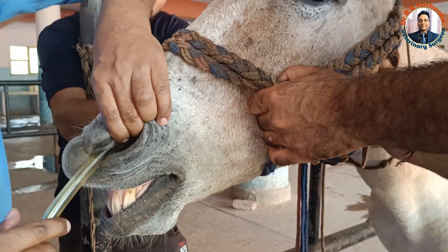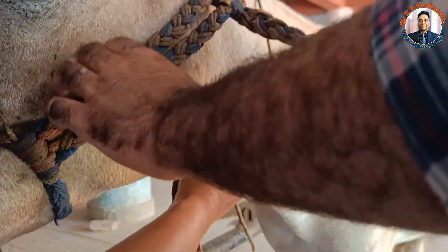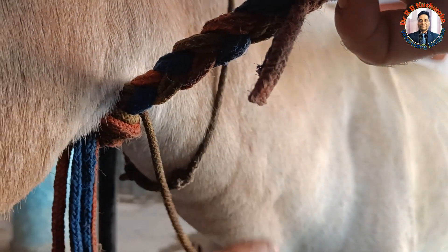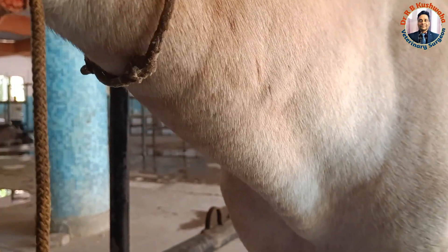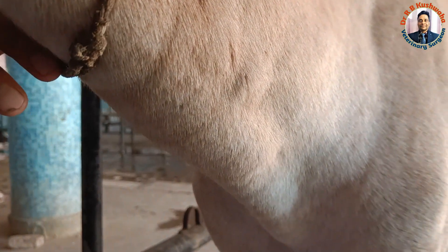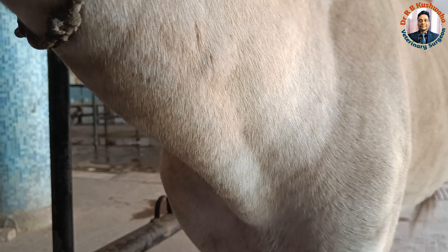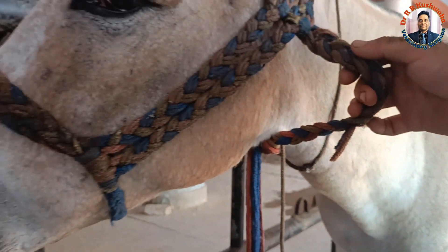The tube is now going through. When it crosses into the esophagus, you can see it very clearly — you can observe the tube going into the esophagus quite easily. There is no problem; it is passing very smoothly.